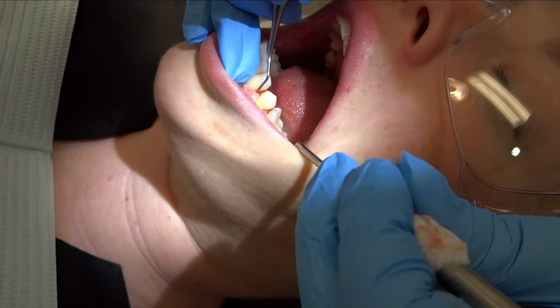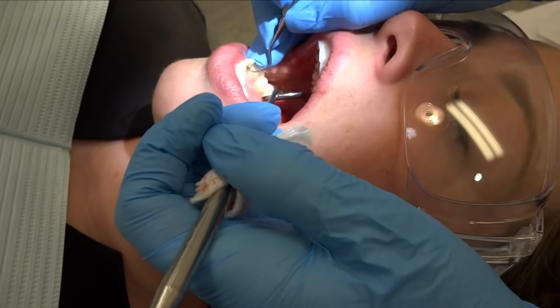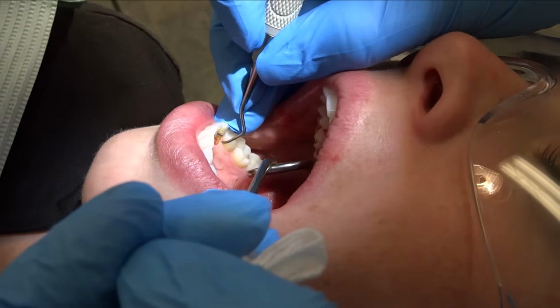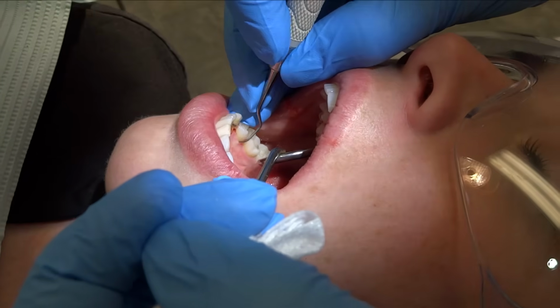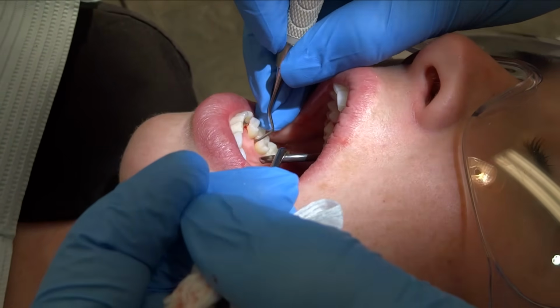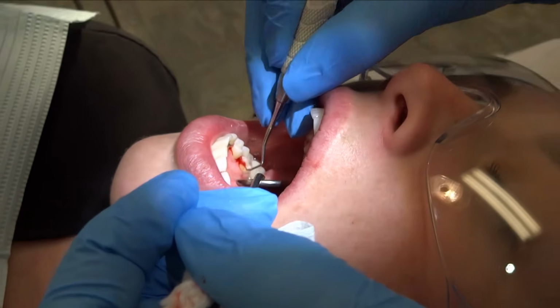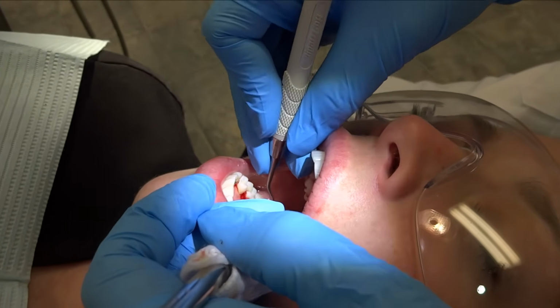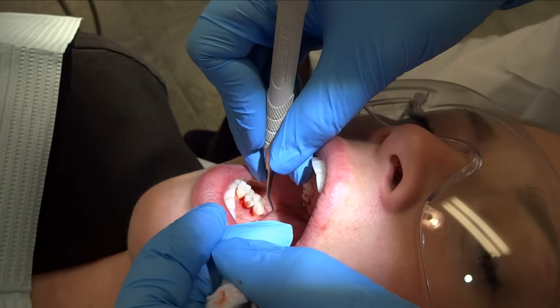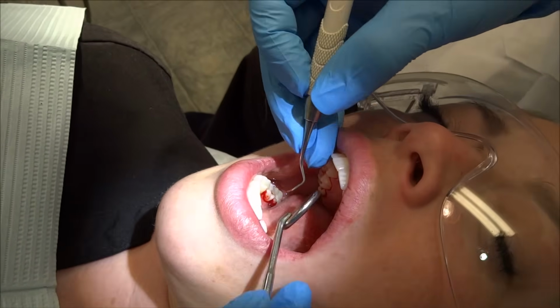Like I said, sometimes I'll treat those distals of the canines as if they were posterior teeth. You can easily adapt those to your posterior instruments. And right here I pop up and I'll do an opposite arch fulcrum. And then her scaling is complete.